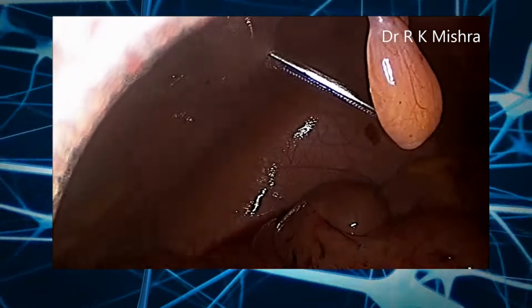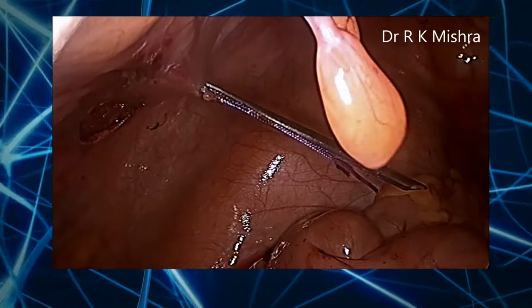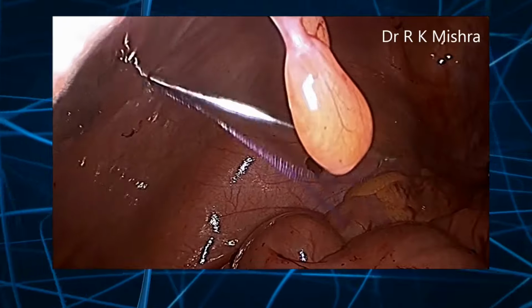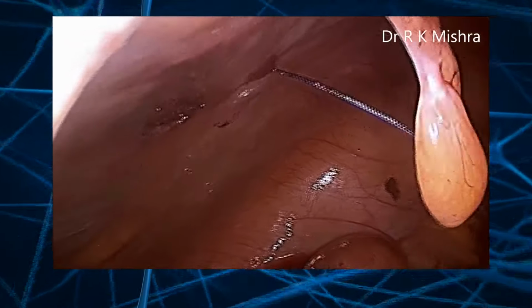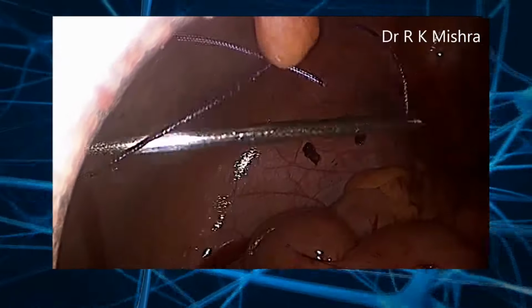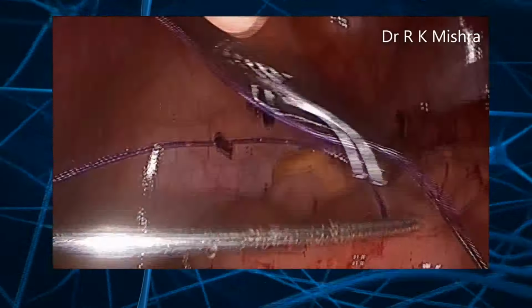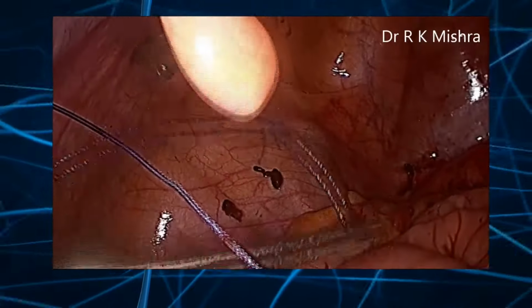Same way. This is a Veress needle for suture passer. This is the Veress needle technique of closing the port. So, this Veress needle has left one end of the suture inside, and then it will go from the other side and pull it, a loop will form, and with another grasper also you can feed it in, that is all.